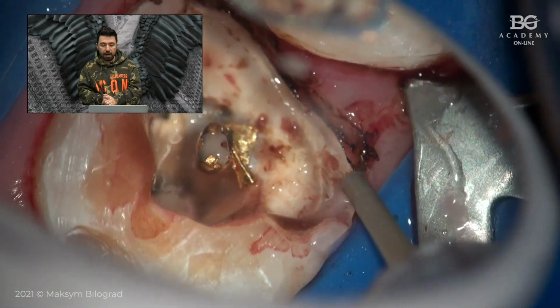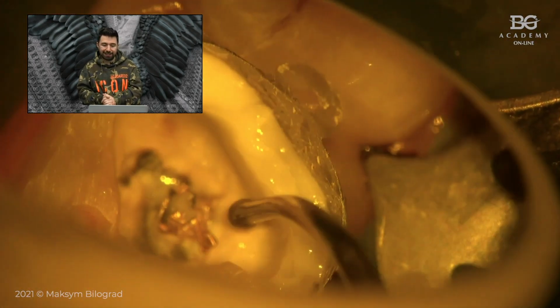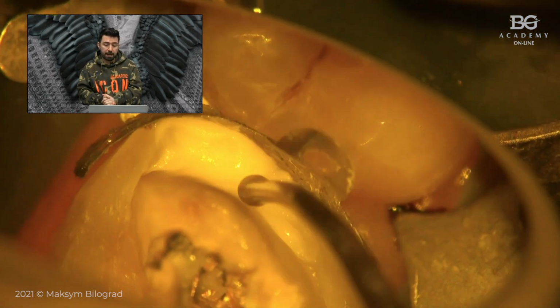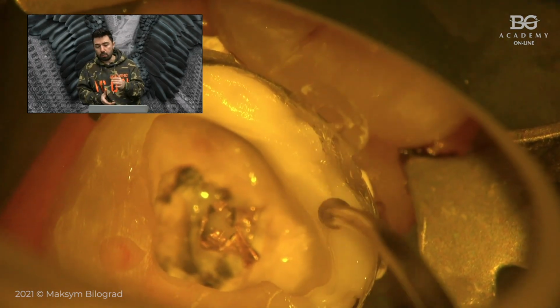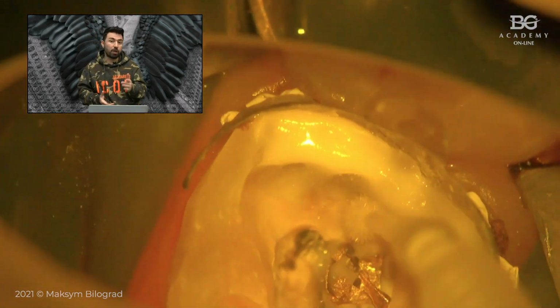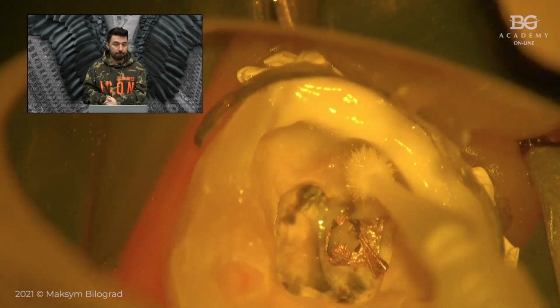Then we would apply the matrix. We will have to secure our matrix. In this case, we use Teflon. We pack it between the adjacent tooth and the one that we restore. And in the adhesive protocol, the bonding protocol, we go for what we call pre-endo build-up, but you can call it deep marginal elevation.